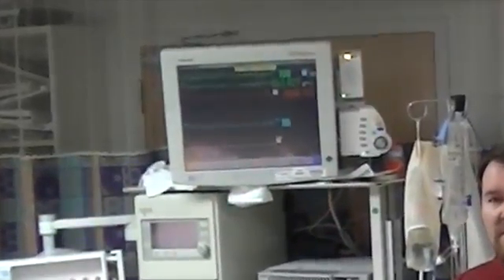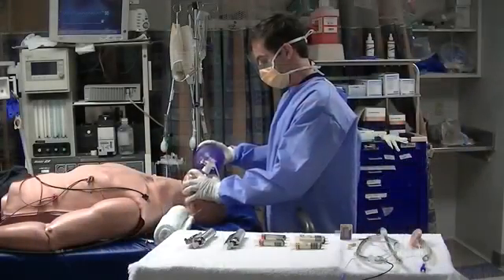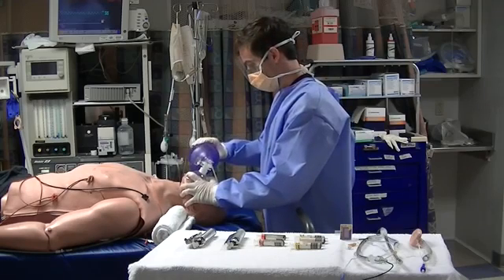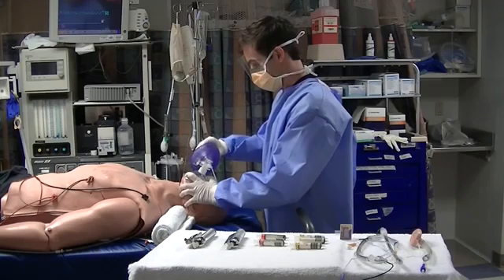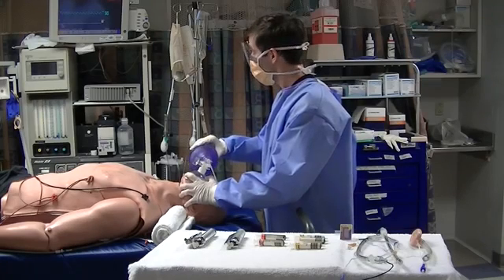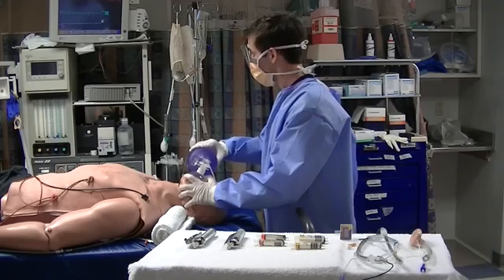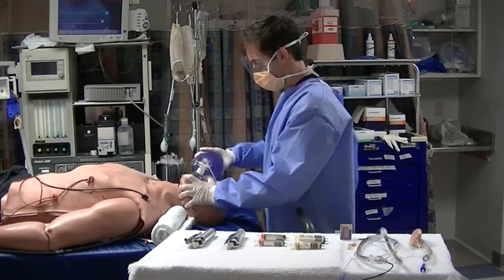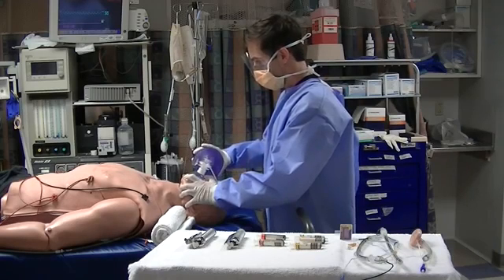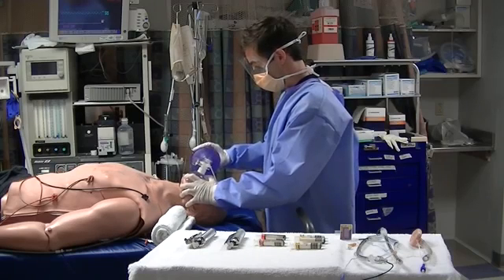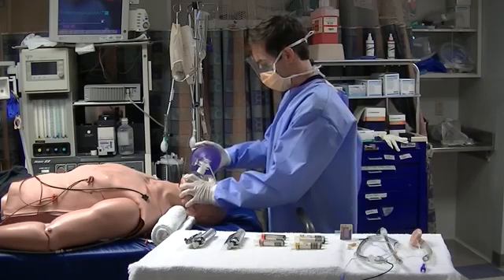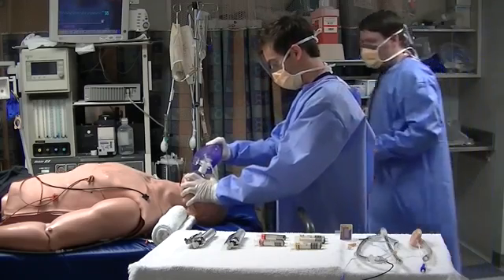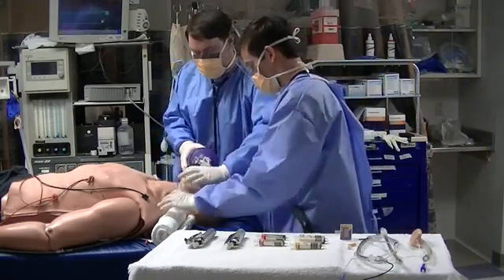This is an example of an ideal setup when intubating a patient. The practitioner is using gloves, gown, and a face shield to ensure adequate protection. Note that each squeeze of the bag valve mask occurs about once every six seconds, which is the normal physiological respiratory rate. Note the practitioner's single-hand C grip, using the thumb and index finger to grab the mask and the third, fourth, and fifth digits to grab the inferior mandible. The practitioner is using a nasal cannula in addition to the bag valve mask to ensure adequate pre-oxygenation.